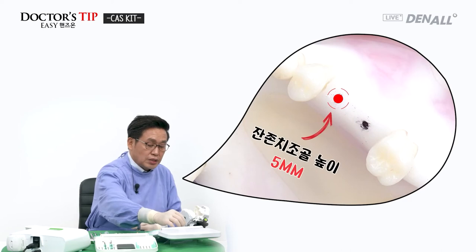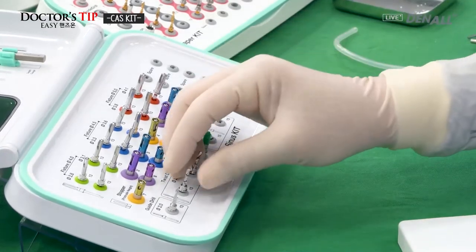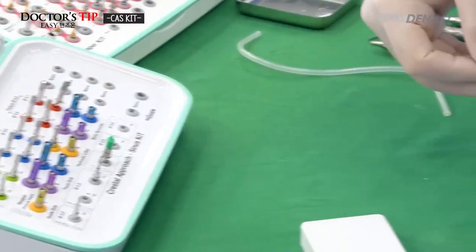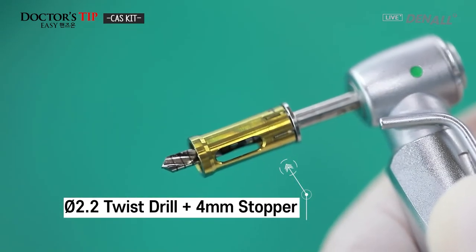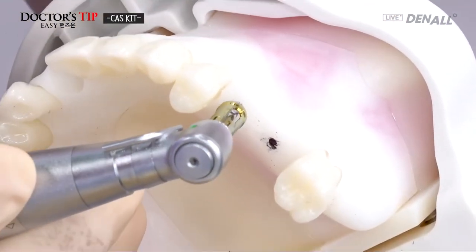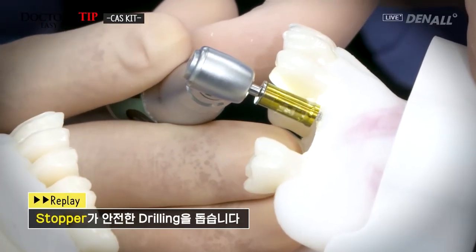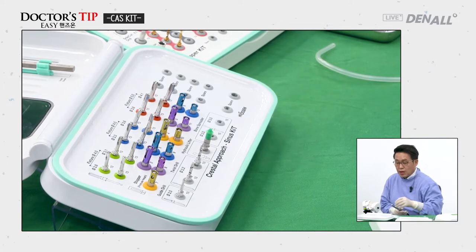In number 25, on the x-ray, the residual bone height is 5 millimeters, so the twist drill is chosen. The remaining bone height is 5 millimeters, so 1 millimeter under-drilling is to be done. So a 4 millimeter stopper is used. 2.2 twist drill. At 25, a 4.5 millimeter fixture will be installed.